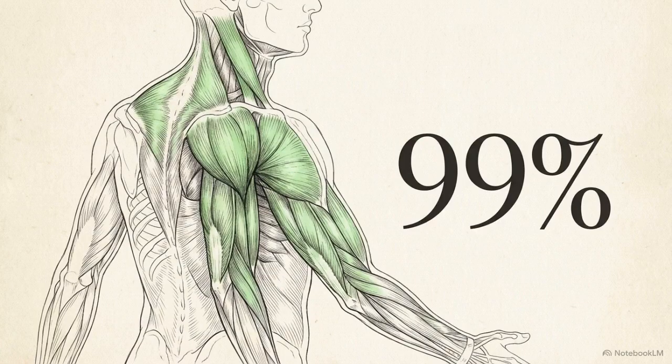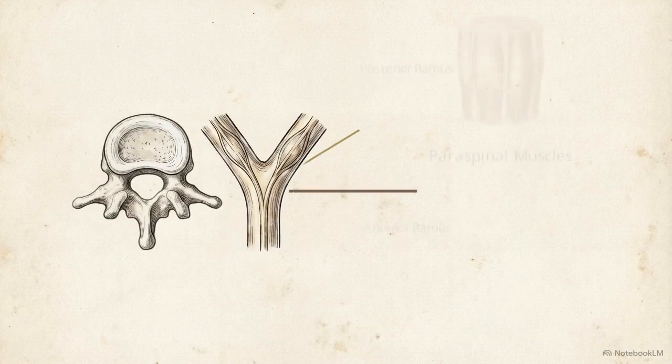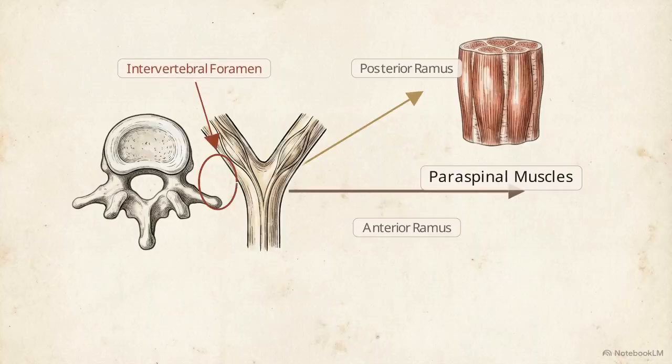When an examiner correctly executes a standard 6-muscle screen covering all common root levels, the sensitivity for detecting a radiculopathy reaches up to 99%. To definitively isolate a lesion to the intraspinal space and rule out a plexus injury, the examiner can also test the paraspinal muscles, which branch off immediately after the nerve root exits the foramen.